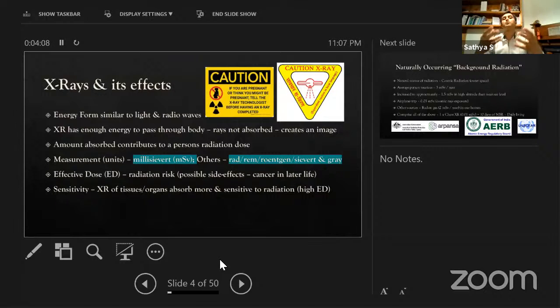The person who is exposed to radiation, for example, the technologist in a radiography area, has been exposed to the radiation coming out of the machine. So exposure plays a major role. We must understand how much a person is allowed to expose themselves. There are many bodies, which we will see in a few slides later, that control and tell us how much a person can be exposed.